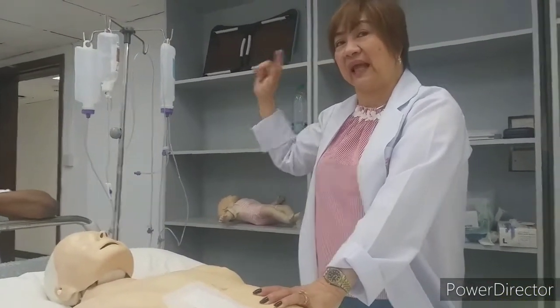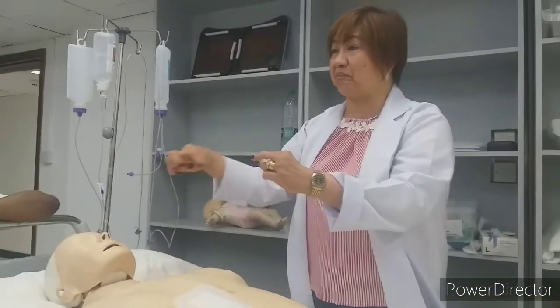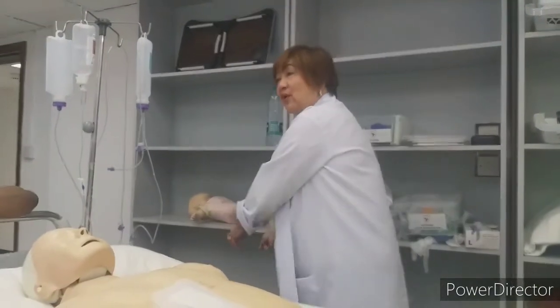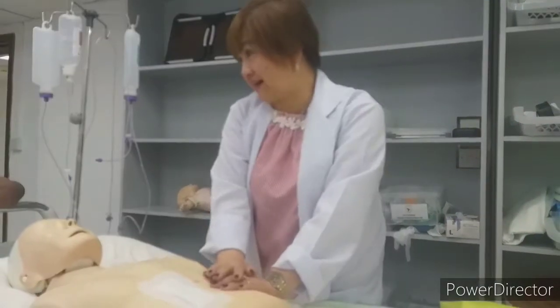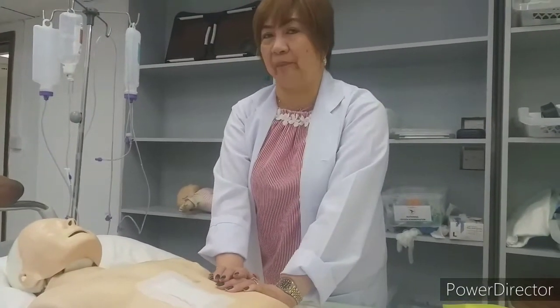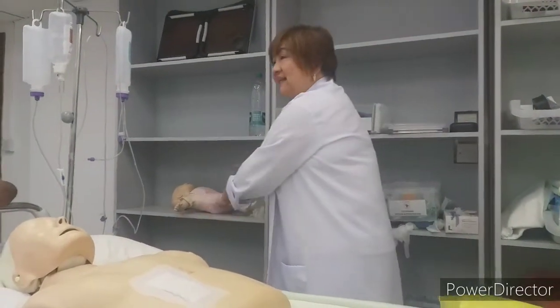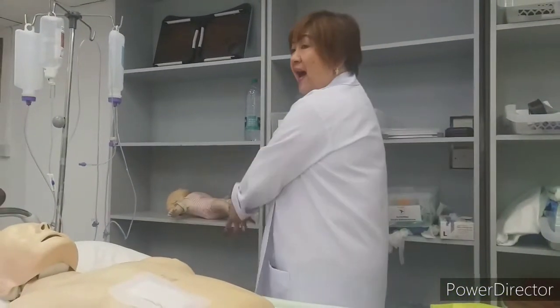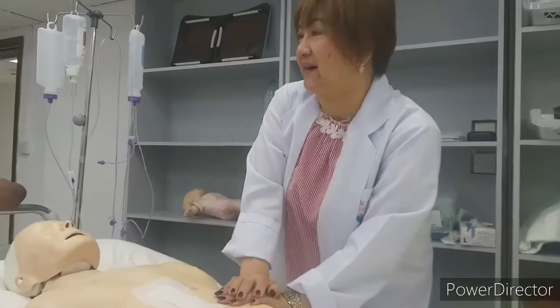Okay? But if the colostomy bag has a zip down here, it needs to be thrown to the toilet bowl, clean that one, and put it back. Better na disposable. Yeah, it's not this one. I told you, this is not disposable. You need to wash it. Okay? Wash it, clean it, the same as you are putting your poo-poo there. Okay? Flush it, and clean it, and dry, put it back.